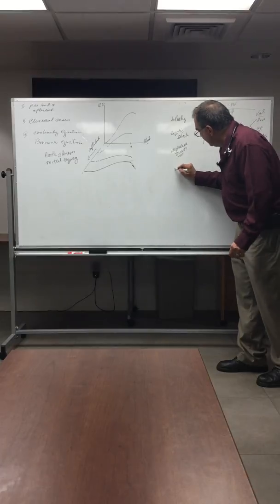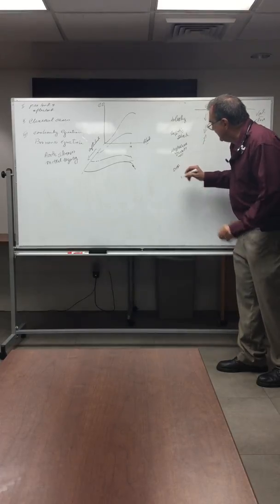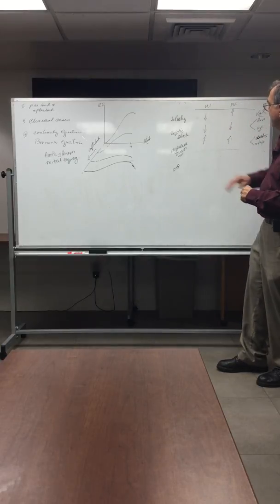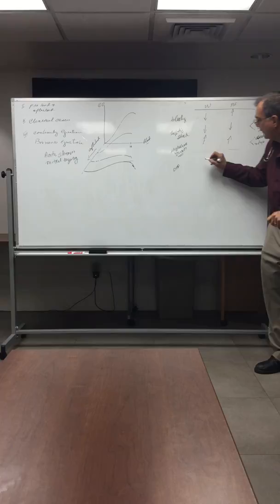Somebody comes in now with CHF, okay? And the CHF is mild, it's not pulmonary edema, but it's CHF. What is the wedge going to be like? You guys tell me, what is the wedge? Going to be high or low? High. You're going to have a high wedge, okay.